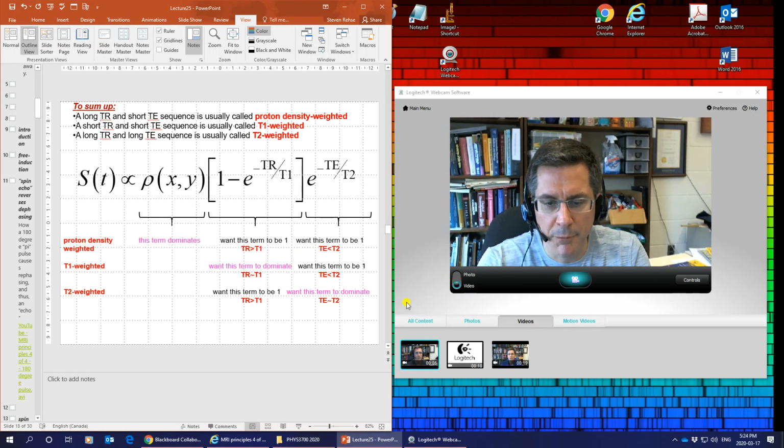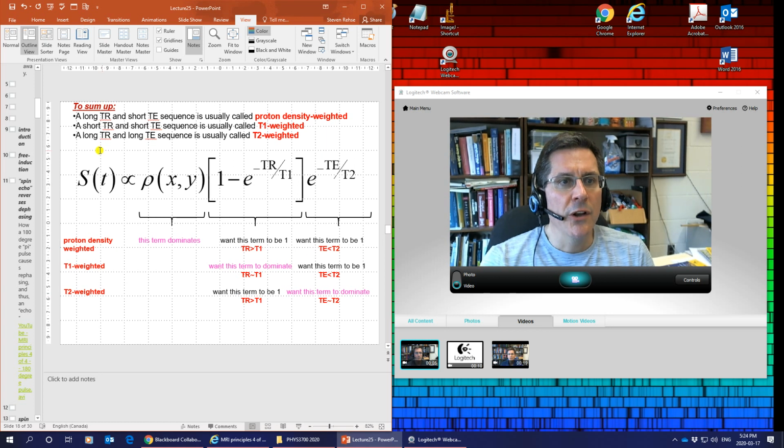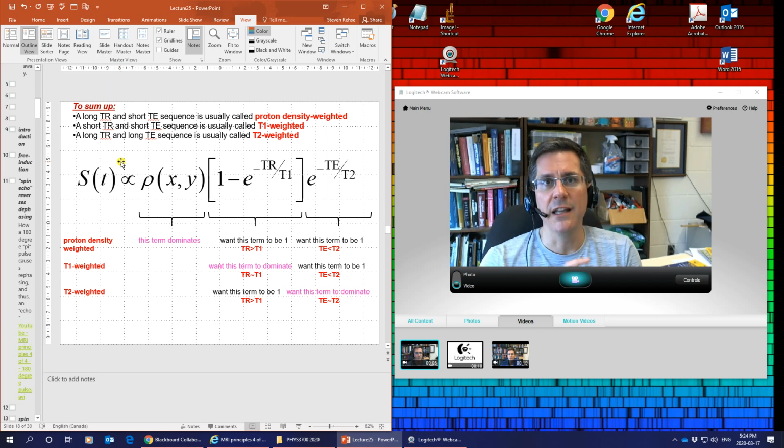So let's just sum all this up. I want to show you this slide here. Here is this master equation. We've got the signal that you measure, and you have a choice. And this is where all the students in this class really get confused. On the other hand, always about 50% of the students can answer these questions perfectly, which you're almost certainly going to see on an exam, on the final or the midterm, which is how do you adjust TR and TE, which are the things you can adjust, to get one of these different weightings.